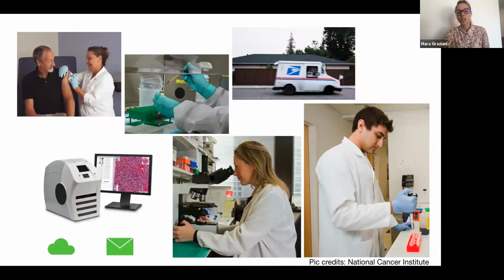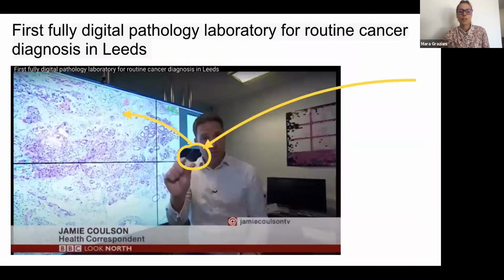A further step was introduced in the last decade to this pipeline that is mostly analogic, and it is the digitalization of the glass slides by scanning them with extremely powerful scanners that can take images at different resolutions to really mimic the different levels of detail that can be reached by a microscope. And here I like this example, the picture where you can see the glass slide in the hand of this man, and just behind him there is the digitalization of it into a slide. So digital pathology essentially is the collection of all of these images for diagnostic purposes.